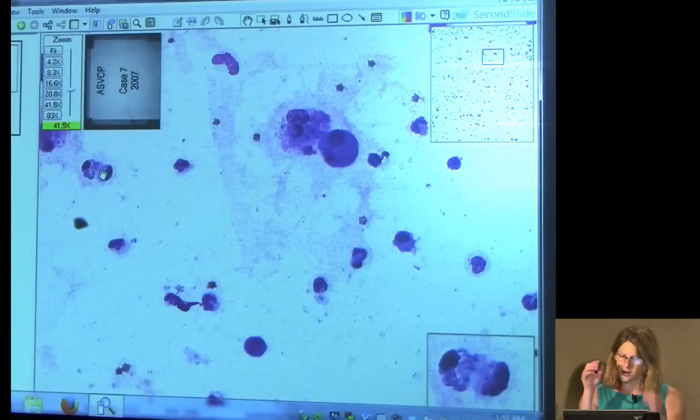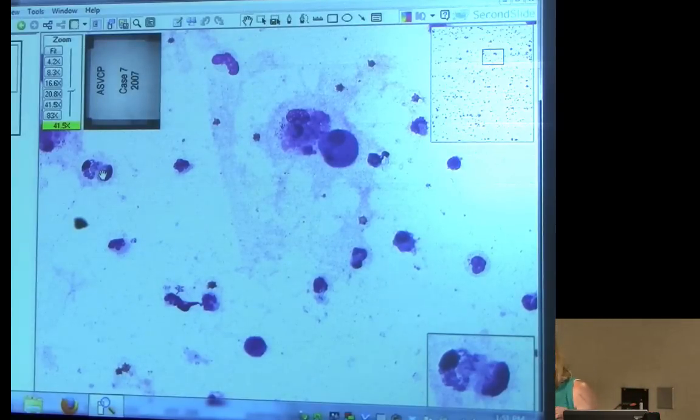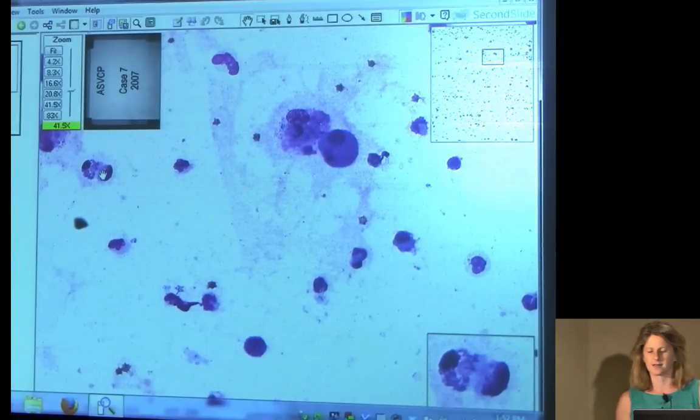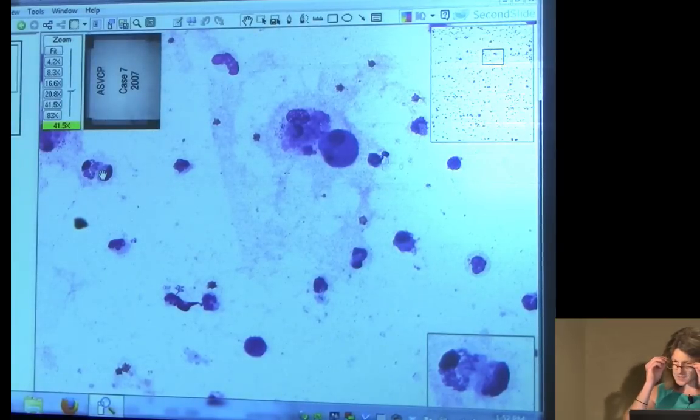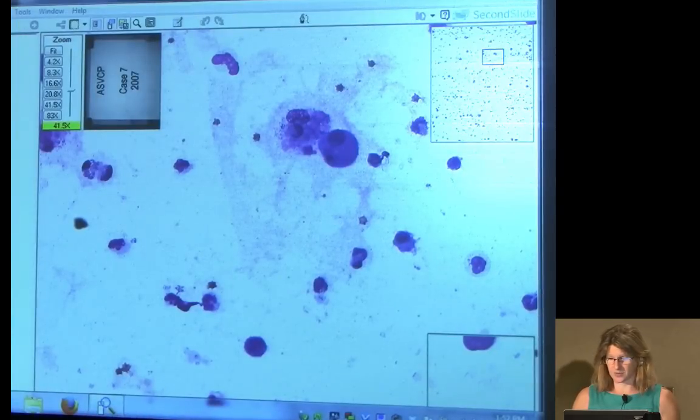And the presence of coccoid bacteria in a macrophage is very abnormal. And when we see that, we think of one particular bacteria, and it's Rhodococcus equi. And we see that in horses, young foals, 3-month-old foals all the time. We see Rhodococcus equi in them, and that's what we expect. But this is pretty unusual in cats, but it has been reported. And so it's kind of a newly recognized disease syndrome in some cats, particularly when they're housed with horses, that they can get secondary Rhodococcus equi infections, because it's not something we typically expect to be a small animal pathogen. Are they subclinical or? No, they're clinical. They have a pleuritis for sure.